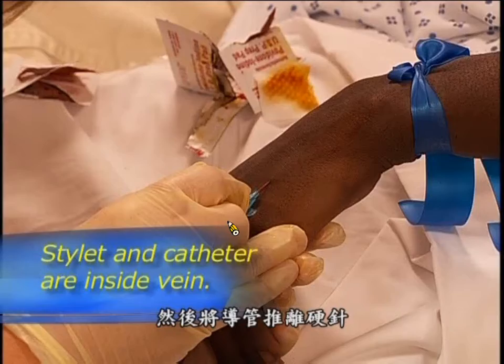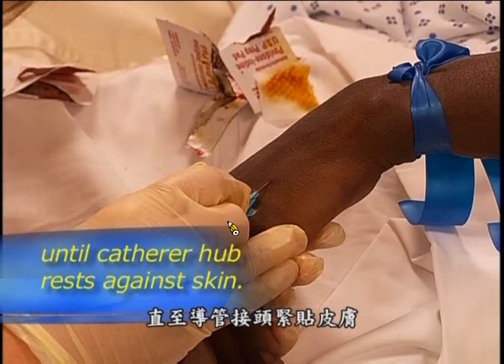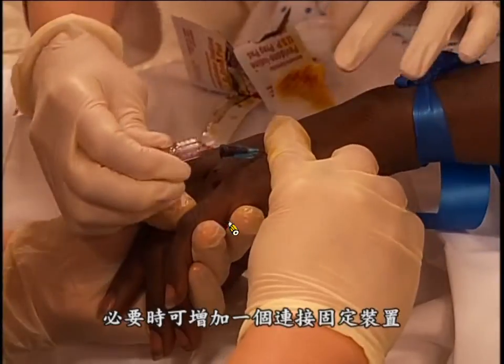Then push the catheter off the stylet until the catheter hub rests against the skin. Remove the stylet while keeping pressure on the catheter to avoid backflow. Remove the tourniquet, then attach the extension tubing and add a junction securement device if needed.